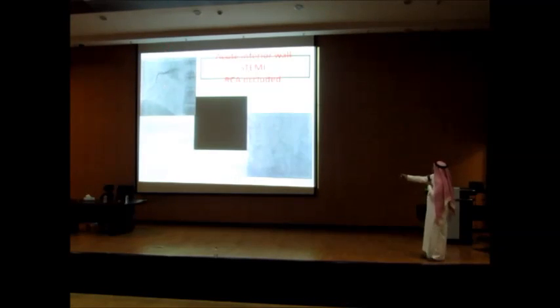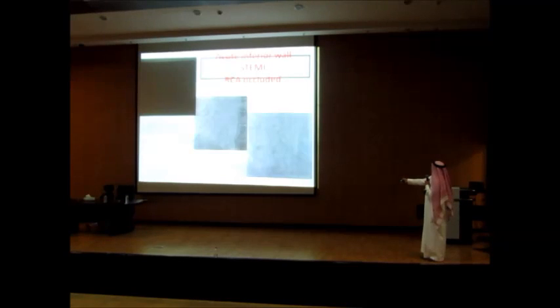So this is the occluded right coronary artery. I think this should show the wire. So this is the wire, the balloon, and the stent there. This is the final result. Look how big that wire is.